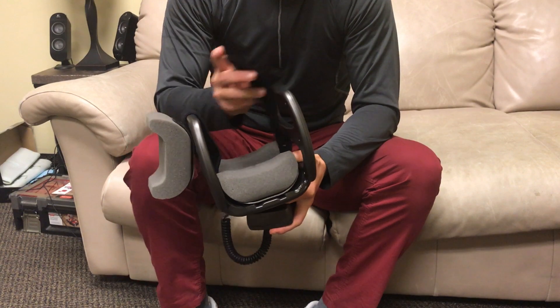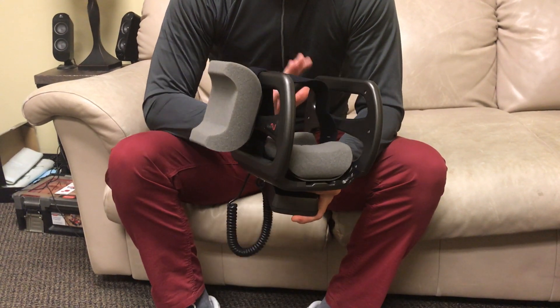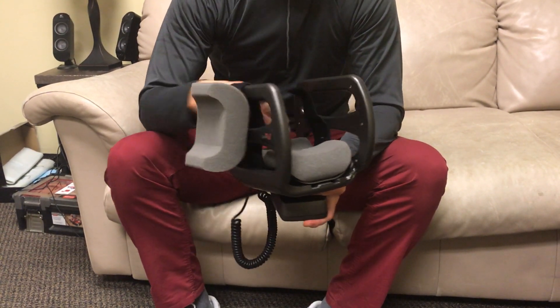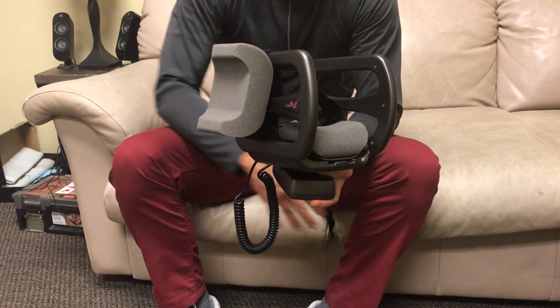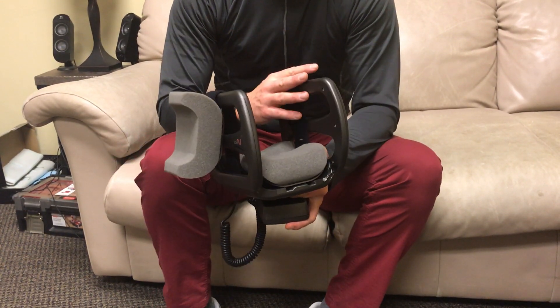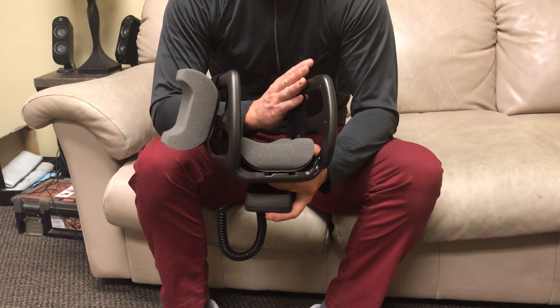You can utilize this unit for a number of different extremities — the hand, the elbow, the ankle, a tibial plateau fracture — but today we're going to utilize it for a proximal humerus fracture.